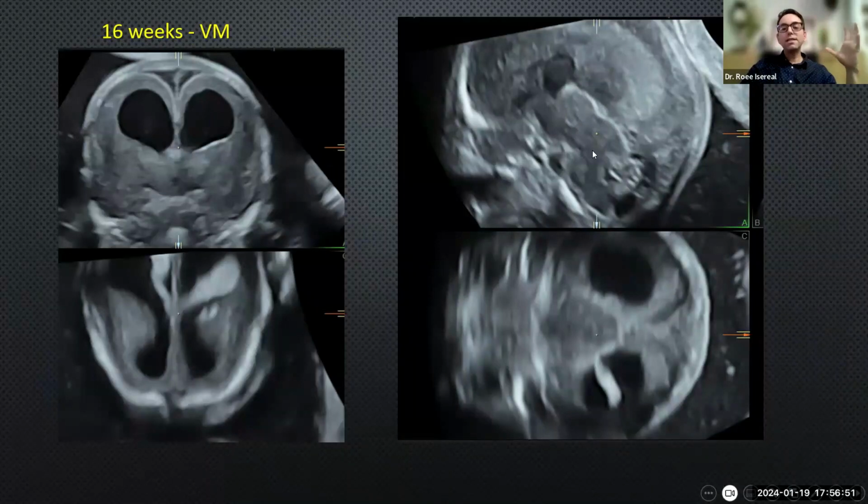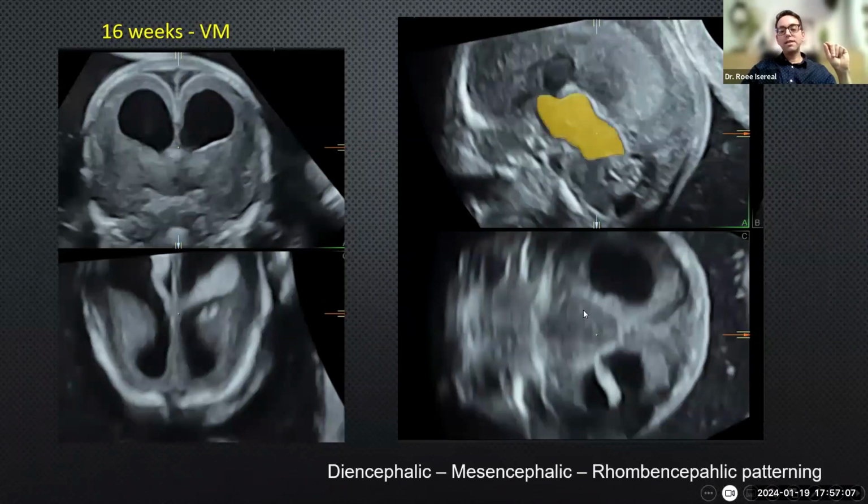mid-sagittal images, you can see that something here is completely wrong, and I talked about it already in my screening talk. Something is wrong here in the continuation between the diencephalon and the mesencephalon. So this is some kind of a diencephalic, mesencephalic junction abnormality. You can see here also that the tectum and the tegmentum look completely abnormal. So something is blocking the flow of the fluid, and it prevents it from going down into the aqueduct. So it gives rise to the early ventriculomegaly.